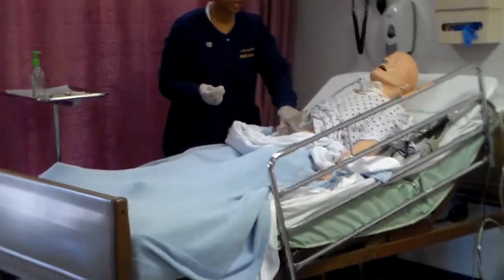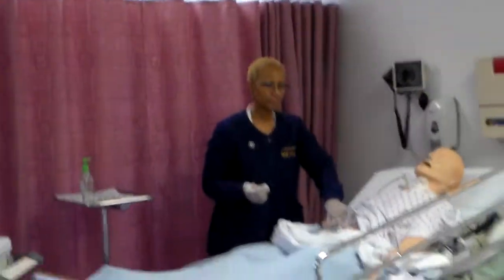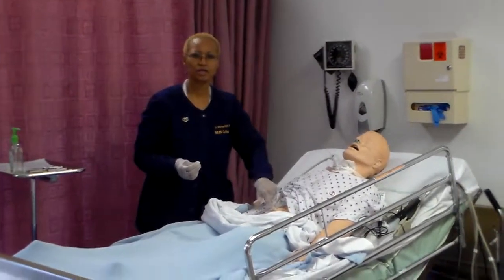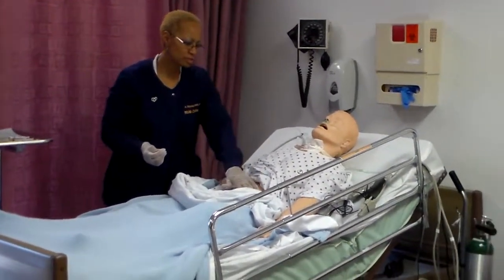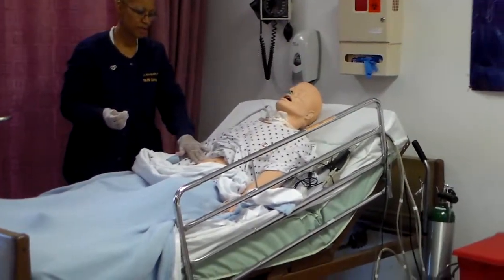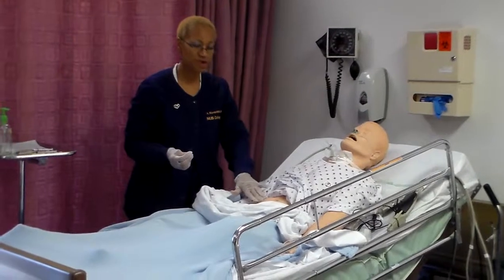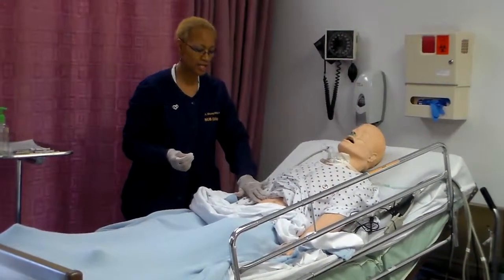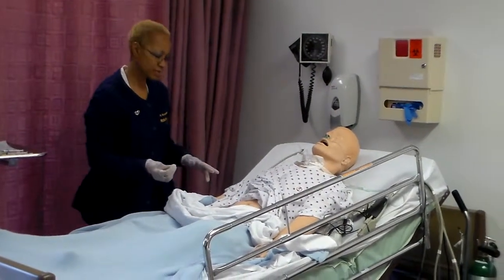Making sure that you stay at least 2 inches away from his umbilicus. You don't want to deliver your injection right at the umbilicus. Also, you're going to be observing for other sites where the medication was delivered before, if there's any atrophy, how much adipose tissue he has, so that the delivery is not one that will be damaging to him.